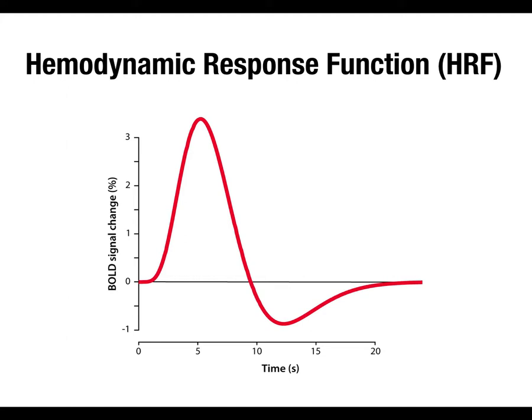All right, so the hemodynamic response function. This is maybe two sides of the same coin, but it's a little confusing that we have two terms. We've got BOLD response and HRF for hemodynamic response function. The BOLD response is basically the effect that blood oxygenation changes as a function of neural activity. The HRF is just this actual line here. It's the time course of the BOLD effect after you see a stimulus.